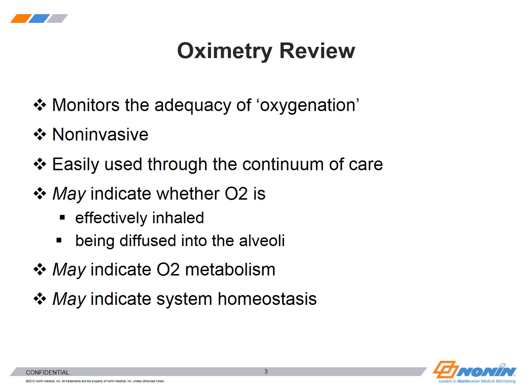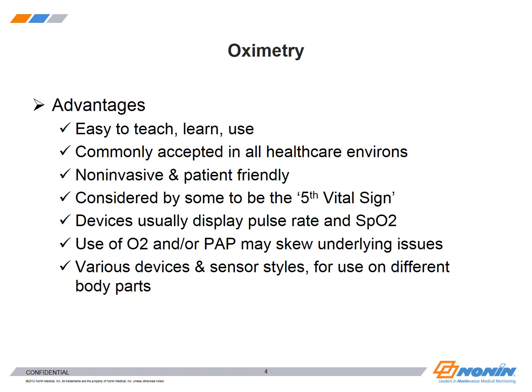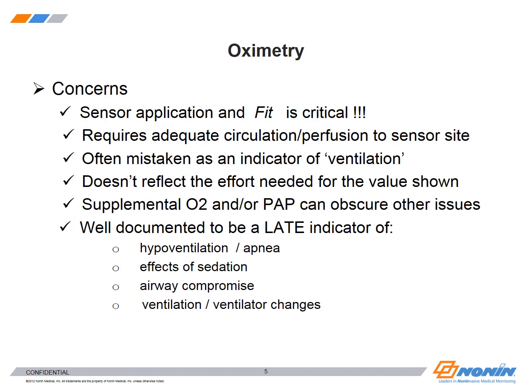That is what oximeters are for, and the next couple of slides will go over why we use oximetry and how it works. So here's a quick oximetry review and advantages of oximetry, and then concerns we have with the measurement of oximetry as well.